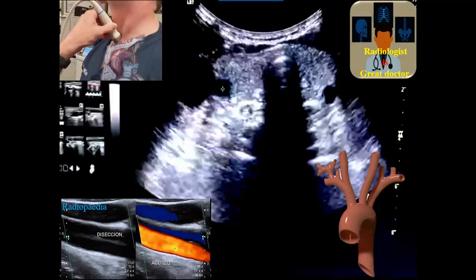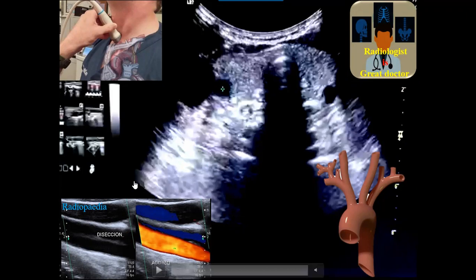Assalamu alaikum. If you are doing the carotid duplex study and you see something like this — a suspected intimal flap within the carotid — it may be a sign of carotid dissection. After completing the carotid duplex study, we may extend the study to see the superior mediastinum.